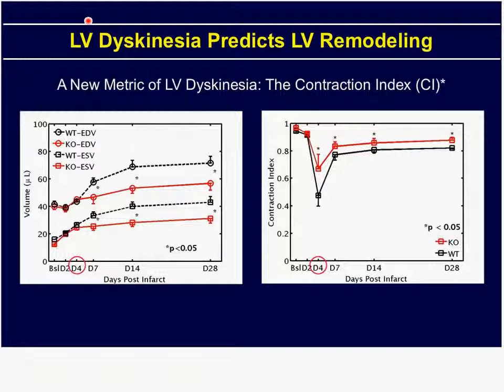So analysis is always 3D in the sense that we are taking the summation of stacks. And the question boils down to how many acquisitions are you going to take, and how much time can you invest in the image processing, and those can depend on variables that are different between centers.